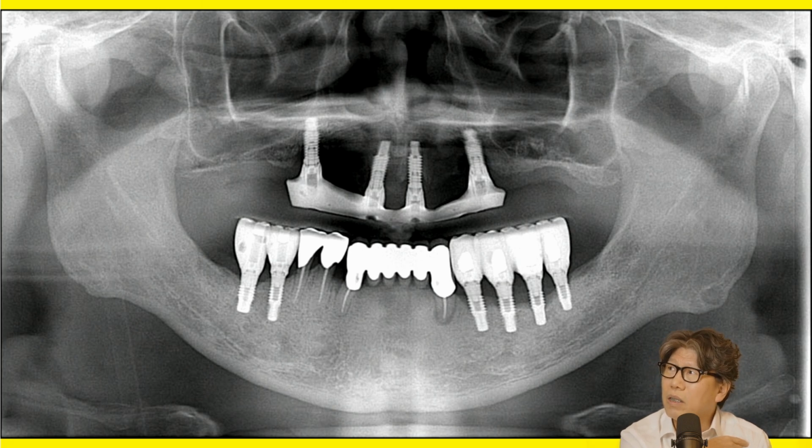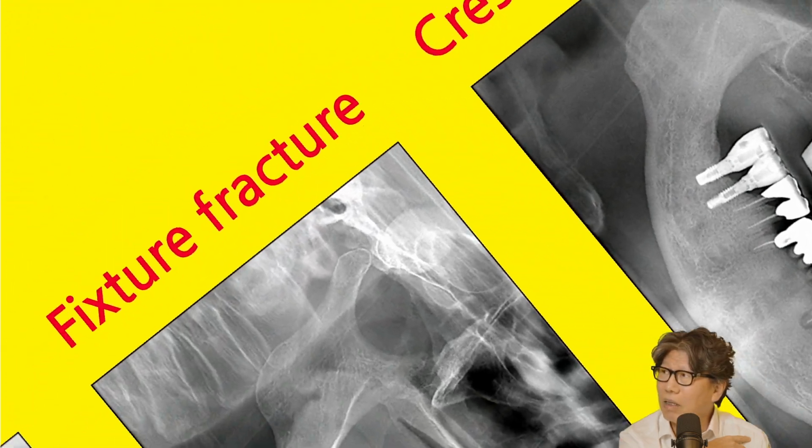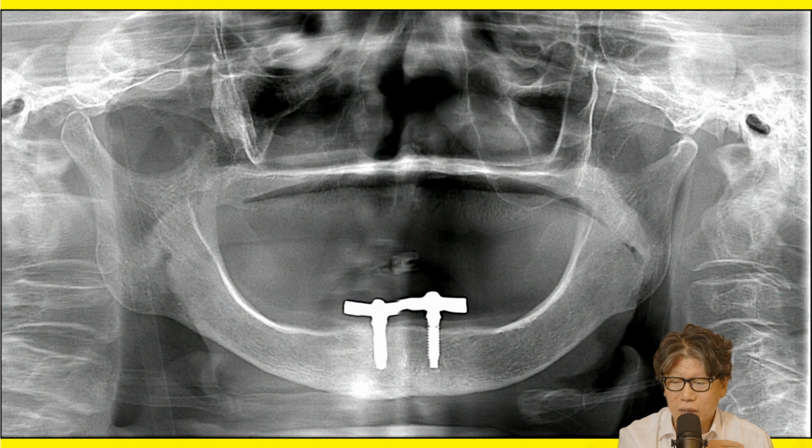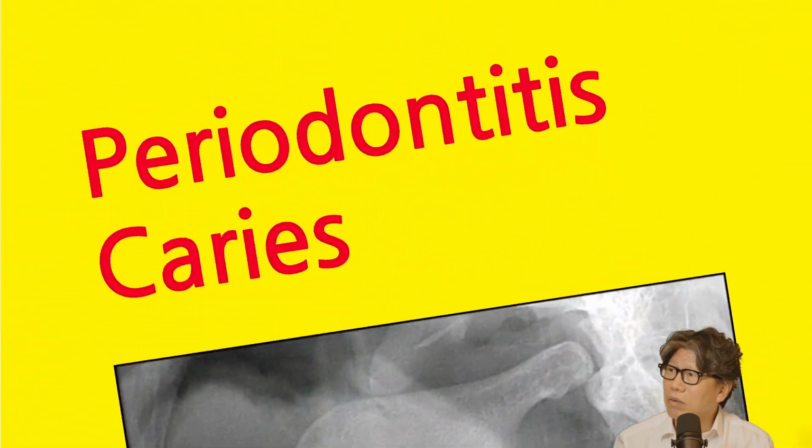Some religious organization planted the wrong implant. There are people who have implants while leaving religion, and they can't even express their complaints and come to me. I remember taking it all out and doing a new one. If you look at this picture, it's broken. The implant was too weak. I can't even speak.